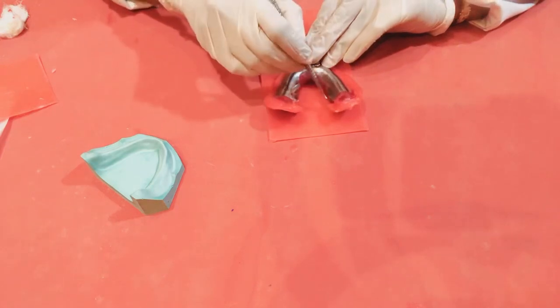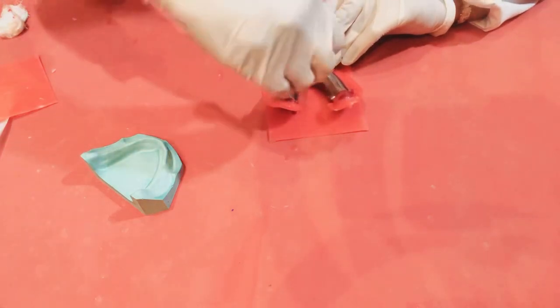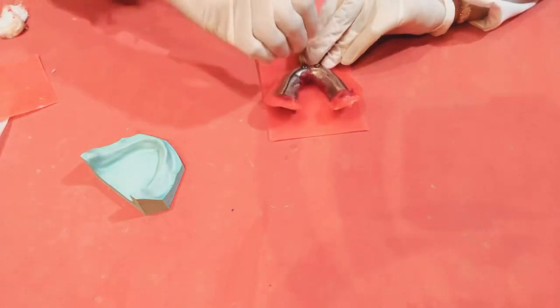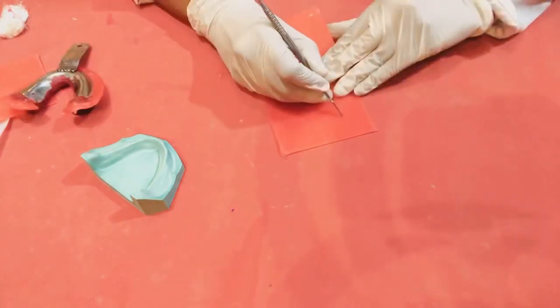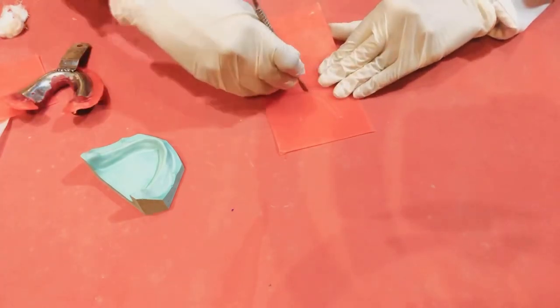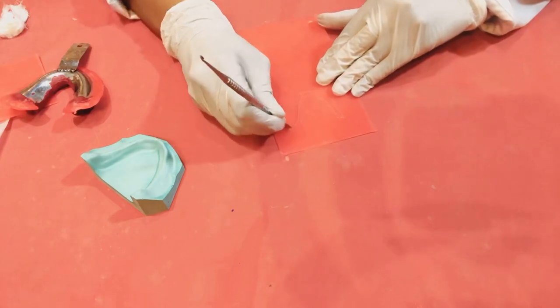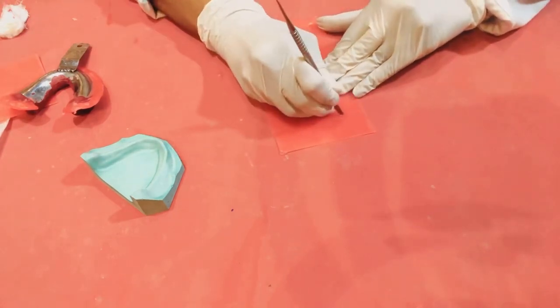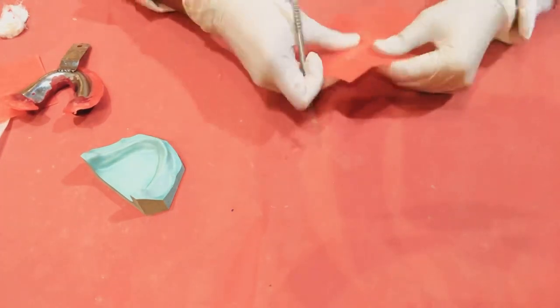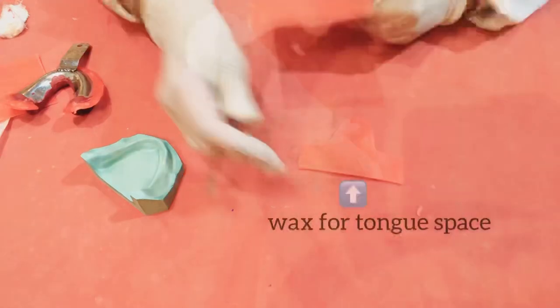Keep a wax sheet below the impression and trace the lingual outline on it. Remove the outlined portion using a lecron carver. Now the wax portion for the tongue space is ready.